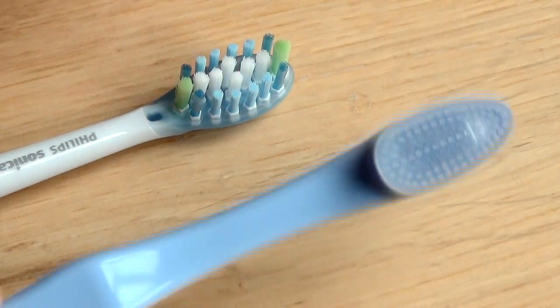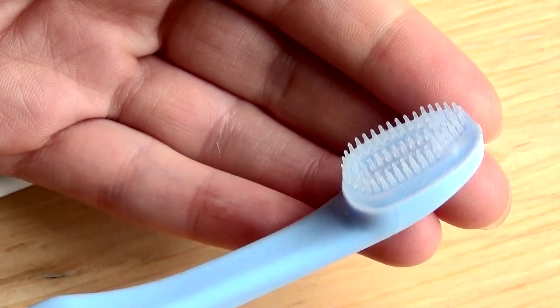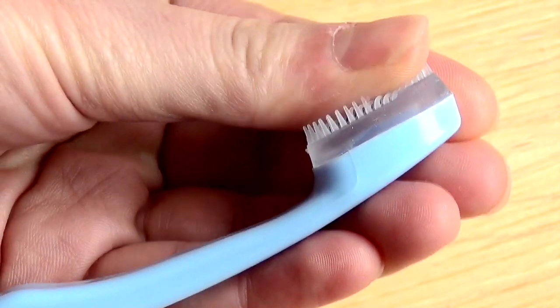As you can see, the Periclean toothbrush is radically different from anything you've seen before. The nylon bristles of a normal toothbrush have been replaced with ultra-soft high-tech cones that sit on a rubber cushion.